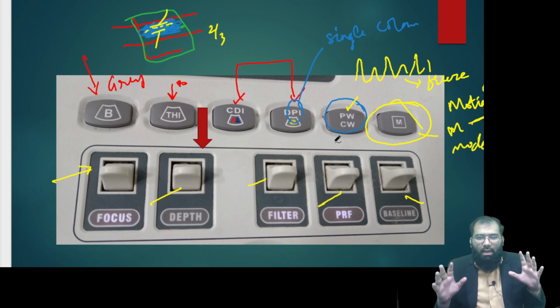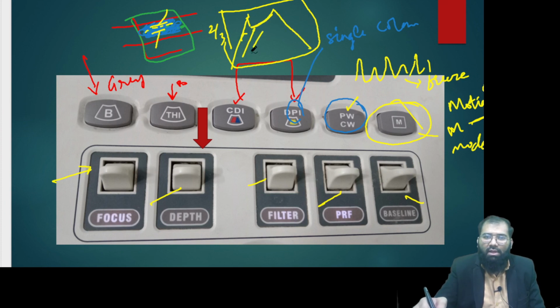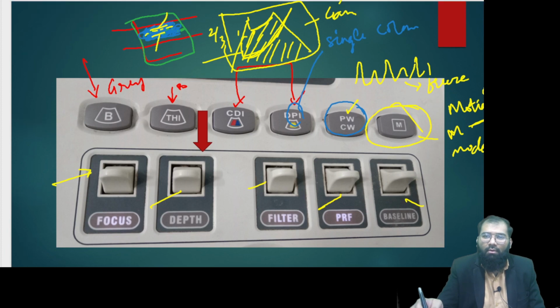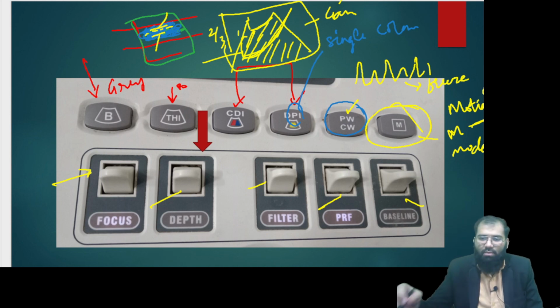Suppose you have switched on your ultrasound machine and your screen is this big, and out of that suppose you are using only this much portion. Suppose you want to see the liver and you are seeing only this much liver and the rest of your screen is all artifacts, then that is not optimum. You have to adjust the depth properly. So you have to decrease the depth and zoom the image, and you have to adjust the proper gain, so that you can make the maximum out of what you have. Okay, so that is the main aim when it comes to understanding knobology.